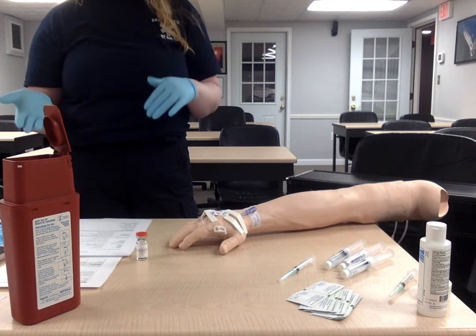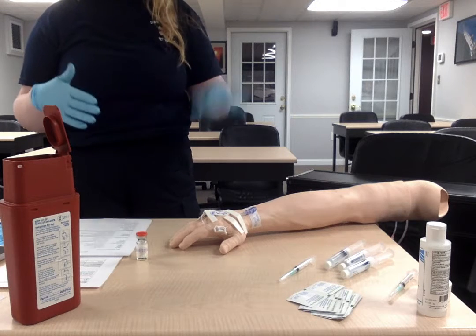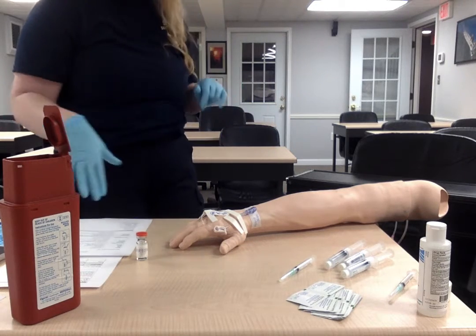If there were IV meds or solutions running, we would have to make sure that there's no contraindications or reactions between the medications, but since she has nothing running and we're only using the lock set, we don't need to worry about that today. So we're going to come over to the line before we do anything.